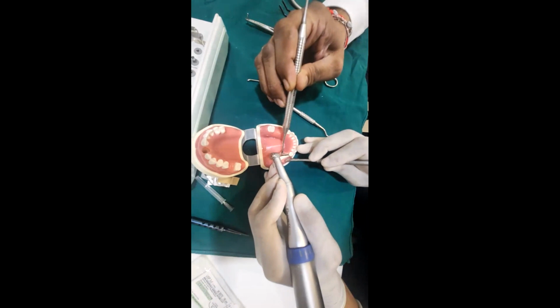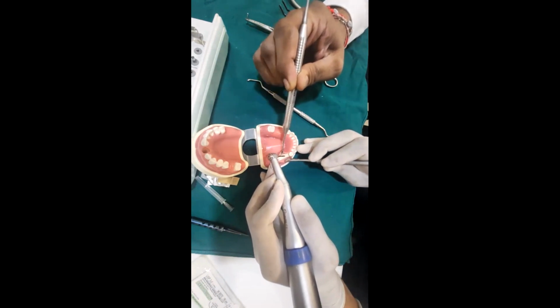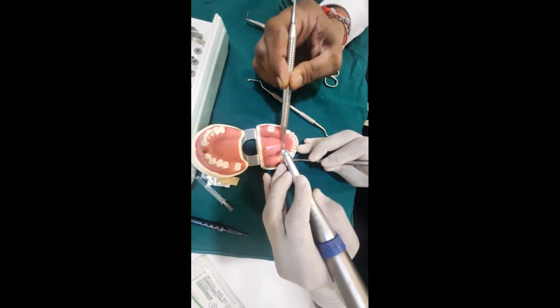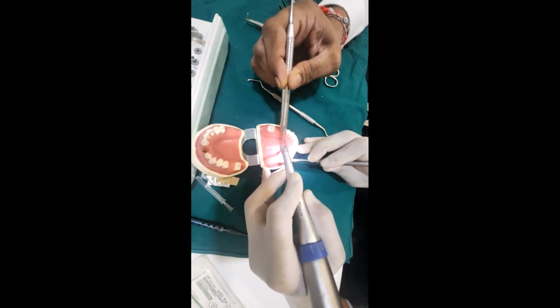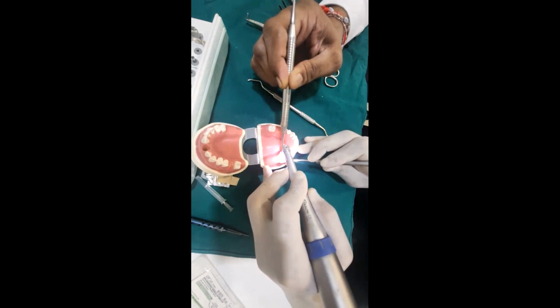This is my adjacent tooth, about 1.5 millimeters minimum, but I would like to have the center of the tooth. This is a premolar, first premolar. So I'm going more towards the center of the crest, a small ditch initially, and then you ensure that you create a little bit of depth.